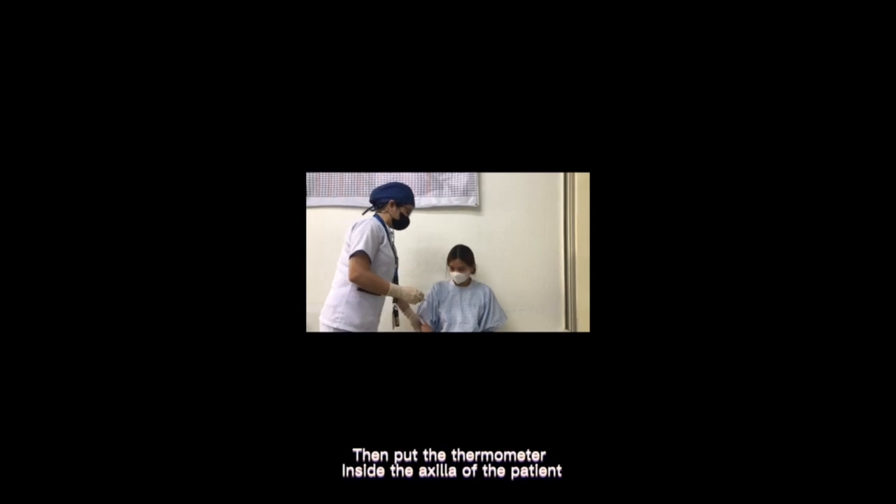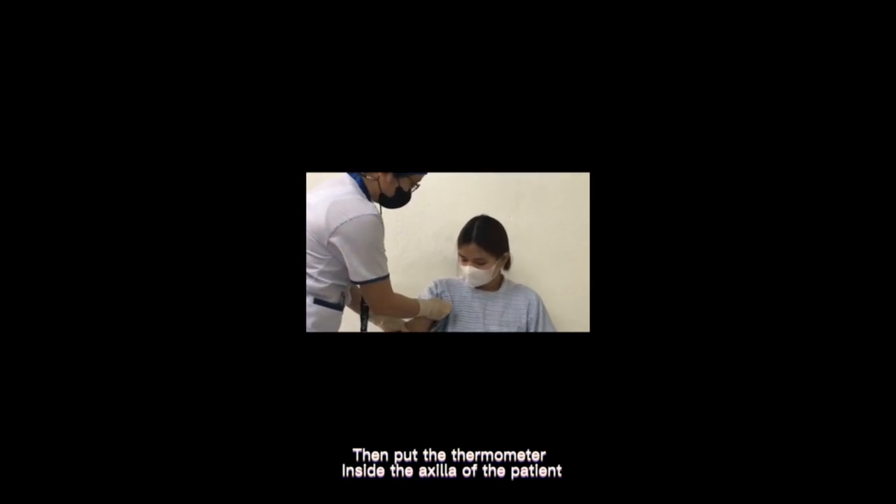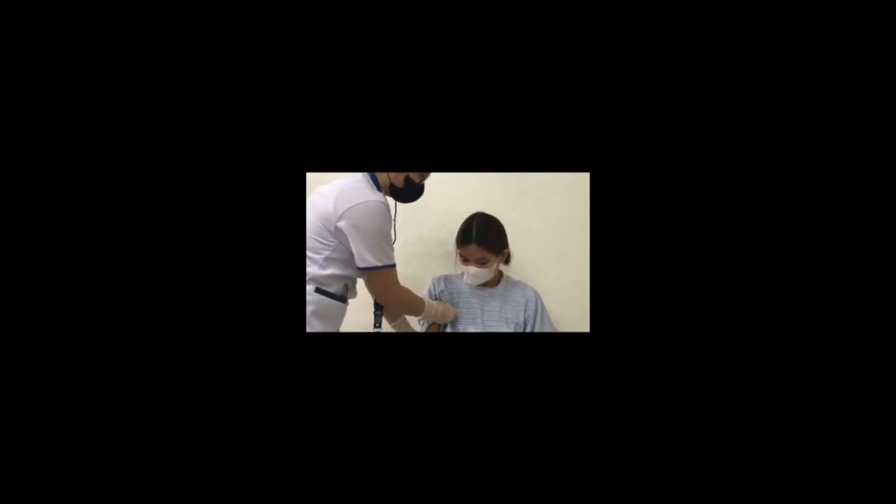Then put the thermometer inside the axilla of the patient. The thermometer will beep when it is ready.